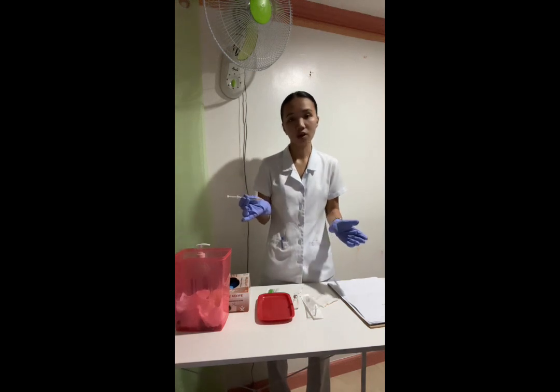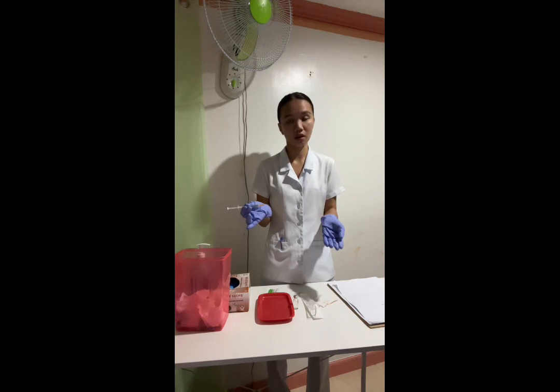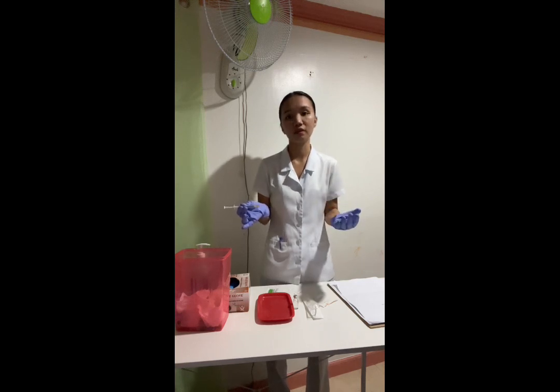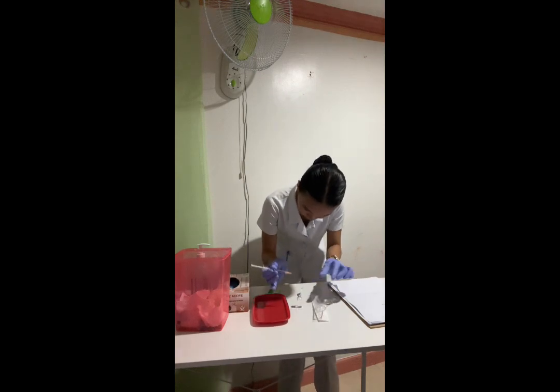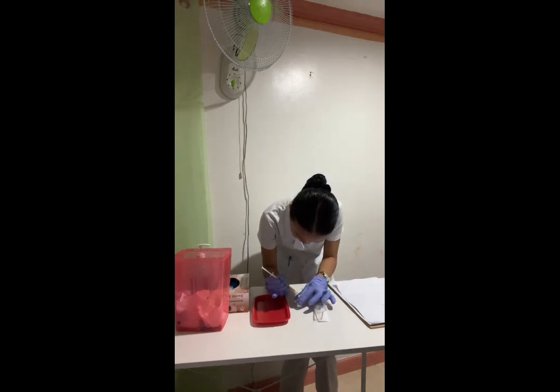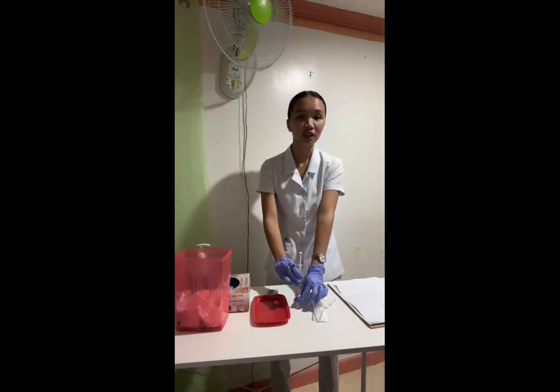And then next is we are going to carefully insert the needle into the upright vial through the center of the rubber cap, maintaining the sterility of the needle. And then after that, we are going to inject the air.